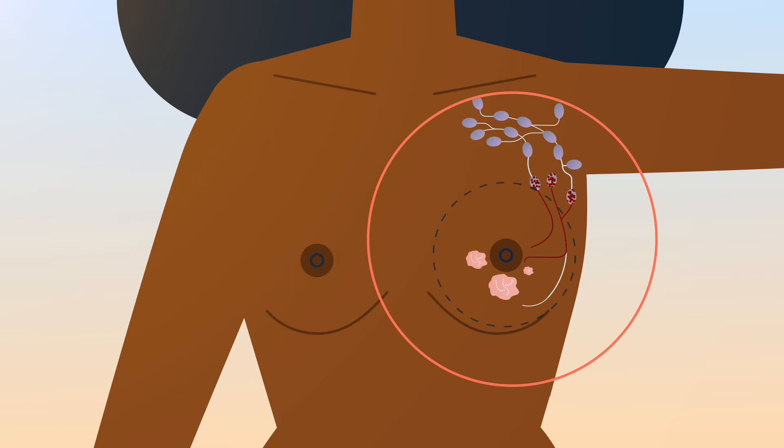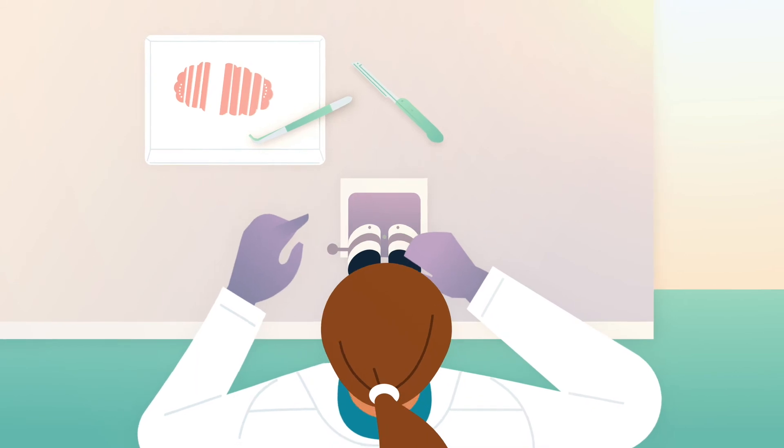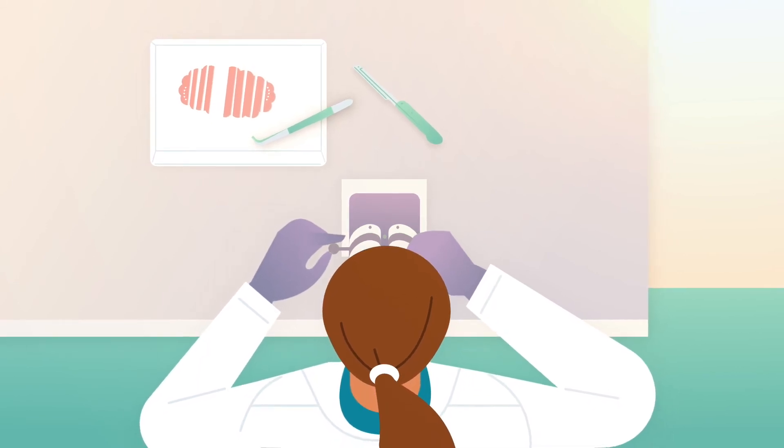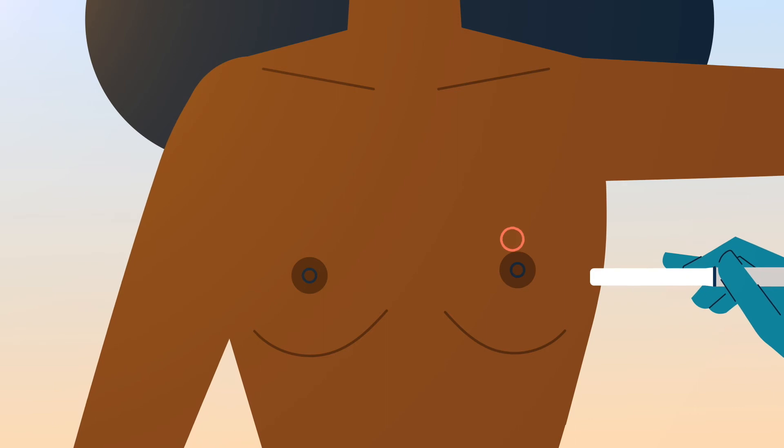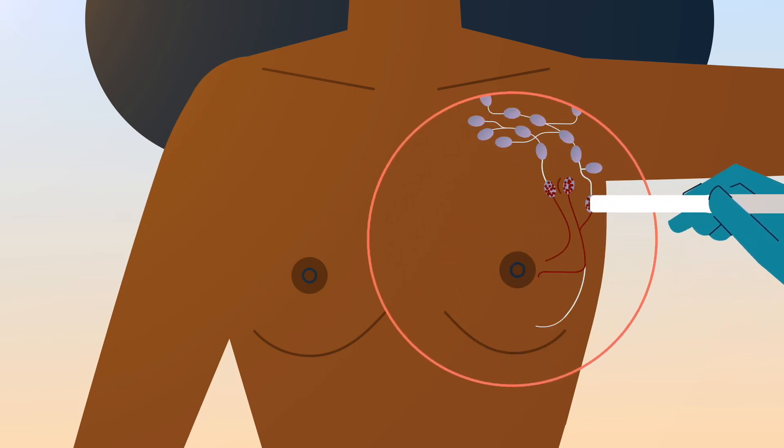After surgery to remove the breast, the DCIS specimen is then closely examined by a pathologist to confirm if any invasive disease is present. If it is invasive, the surgeon can schedule a sentinel node biopsy with confidence that the lymph nodes will be easily found, having been marked with MagTrace.